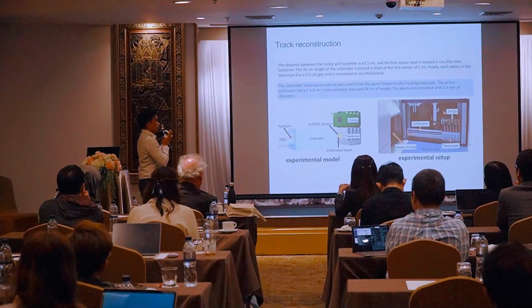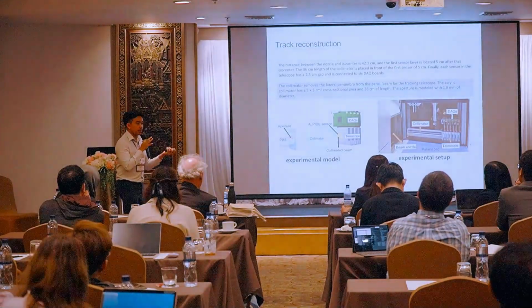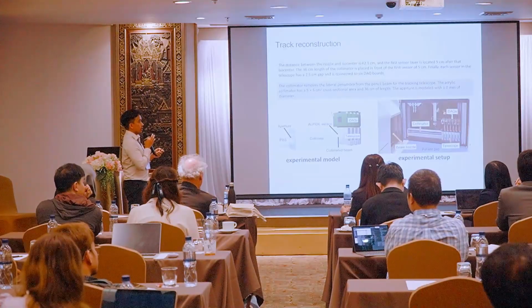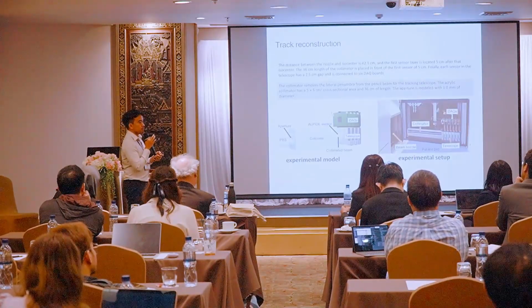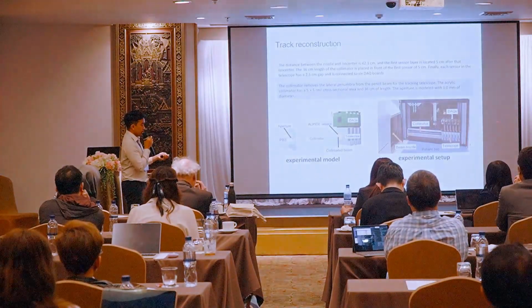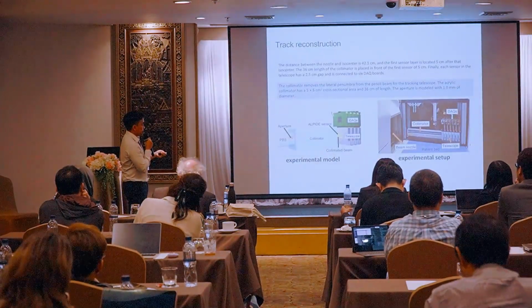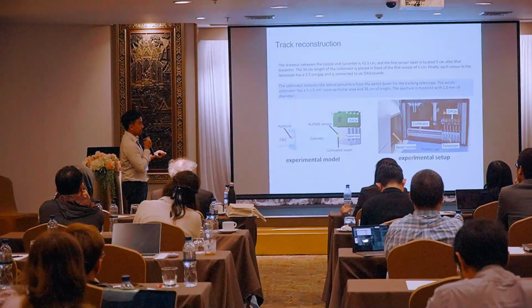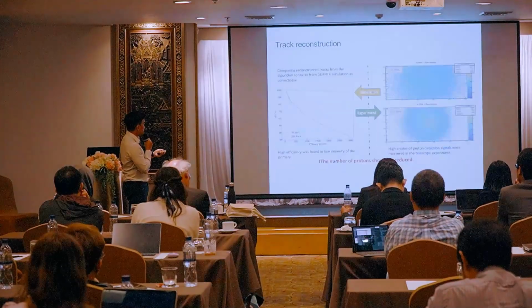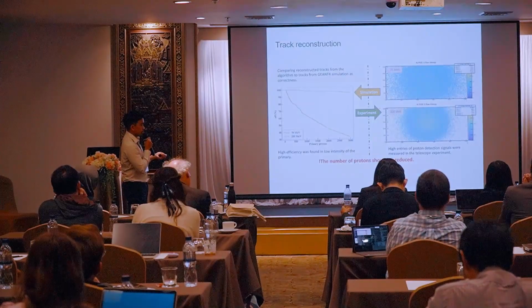I would say another problem is that there are too many protons coming in. If I remember correctly, it's 10 to the 9 protons per second or something. Maybe I'm wrong, but it's too many protons coming to our sensor. This means we have to produce a collimator. We just made a collimator from acrylic to reduce the number of protons so that we are able to measure the proton beam. But without the collimator, the beam looks like this in our sensor.